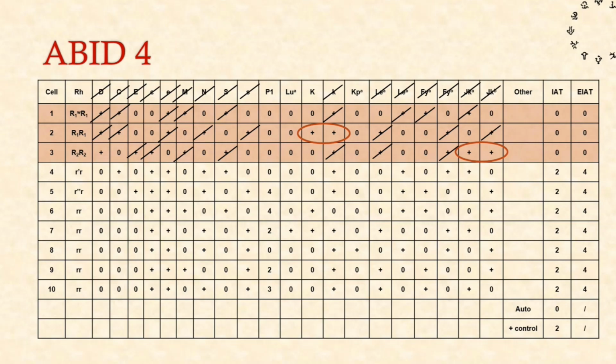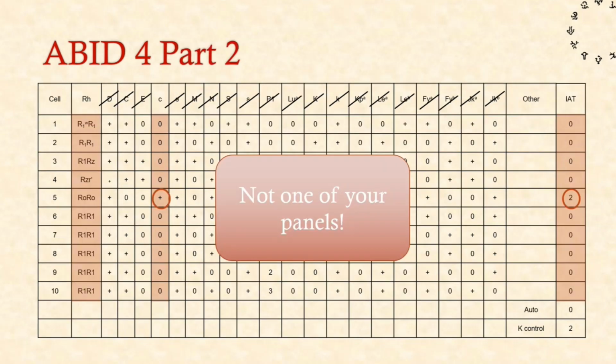So with this panel, unlike the little e, you can actually get rid of quite a few things, but it doesn't mean that you can actually get your 2 positives and 2 negatives for the antibody that you would be looking at. So what you need to do at this point is you might have another panel that you want to use, or you'd probably again refer it to your reference laboratory. And then we'll have another one of these panels. And again, this isn't one that I've sent out, just so you're not thinking about what you're doing here.